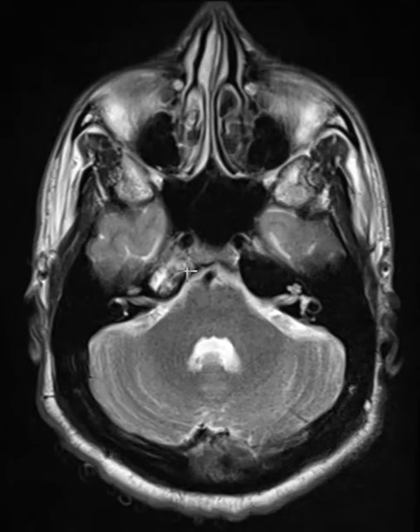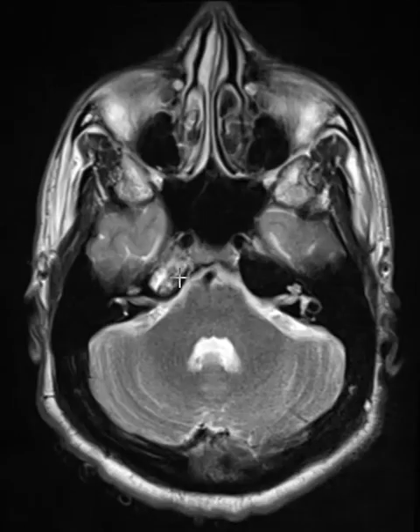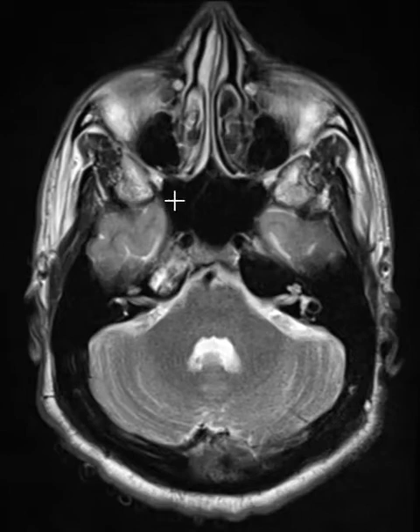The mastoid portion looks great — nice and open, filled with air and bony struts, all dark and uniform. But over here we see there is no pneumatization; this is bright. The question is: what is this? Is this an inflammatory process, which we call petrous apicitis — inflammation of the petrous apex — which can cause inflammation of the trigeminal nerve and bad facial pain? It can be a dangerous condition because it's so close to the brain. Or does this non-pneumatization simply mean there's no air and it's just fatty marrow?